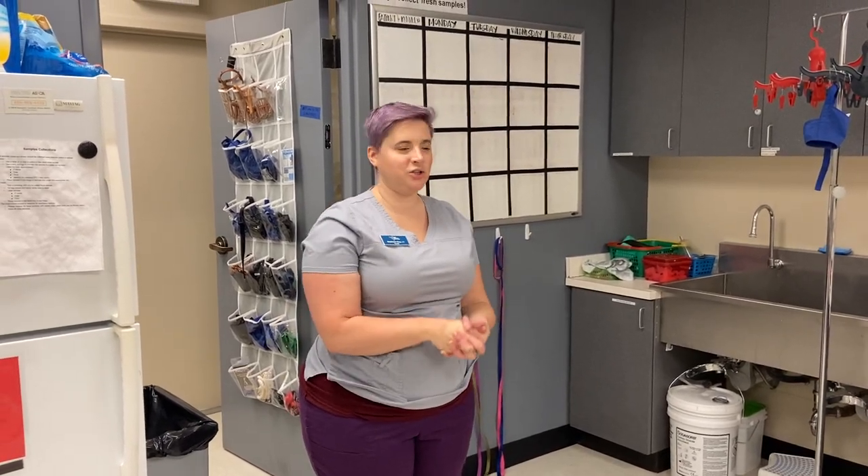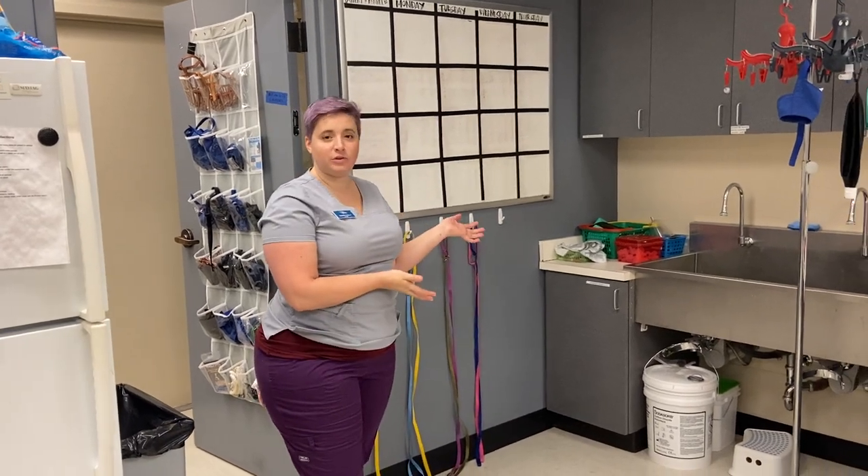Hi, I'm Miss Stephanie and I'm going to show you how to hook up a rebreathing circuit to an anesthesia machine. First I want to show you where some of these things are located.